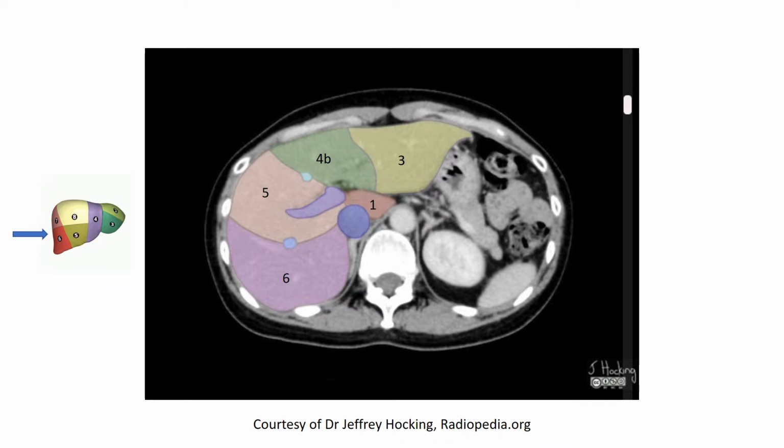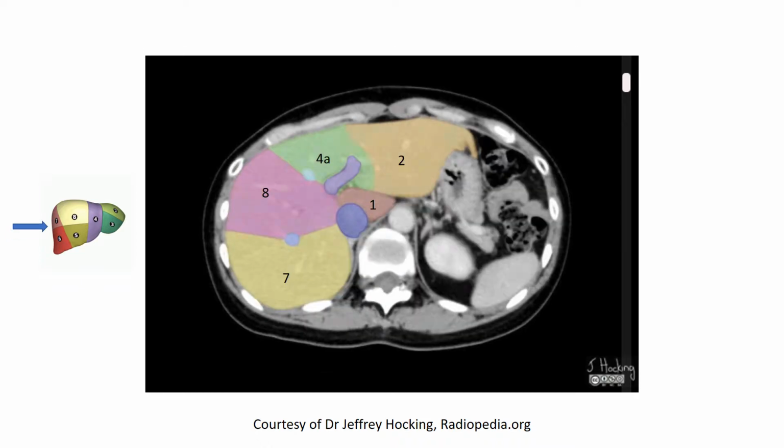Now let's just pop above the bifurcation, and in the next few images we're just going to pop above and below. And popping just above, you can see that it really is quite simple. 6 has become 7, 5 has become 8, and so on.